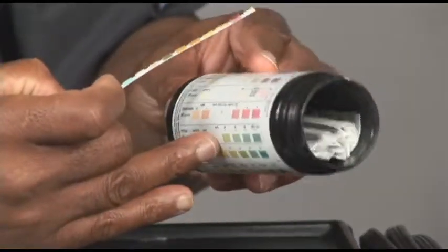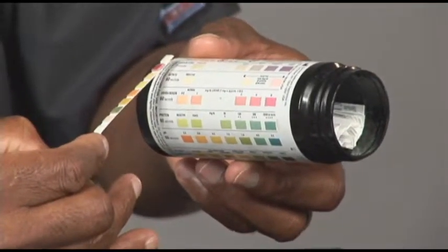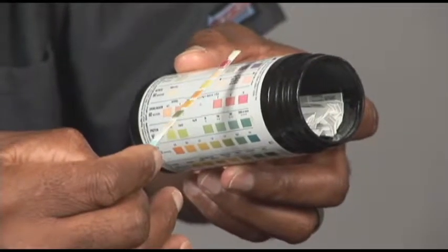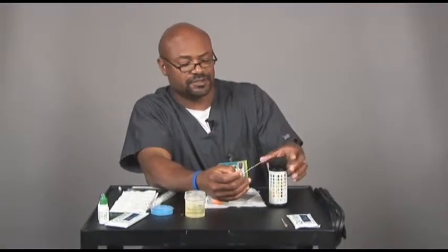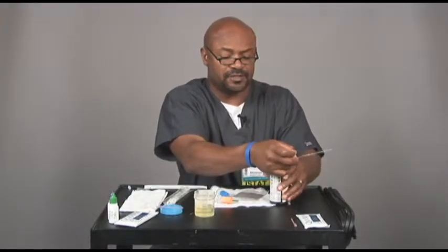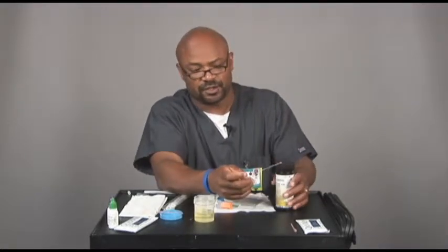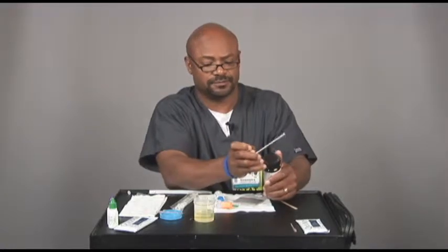The main thing about the leukocytes is it takes 2 minutes for this test to completely perform what it's going to do. Usually, you need to wait the actual 2 minutes, not the usual emergency department 2 minutes, which we think is 30 seconds. So take your time and wait that 2 minutes, because some will result fast, some will take that 2 minutes to result.